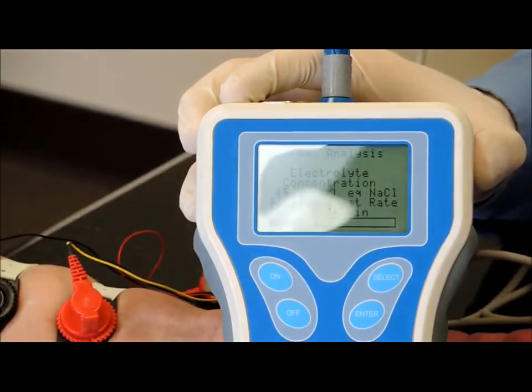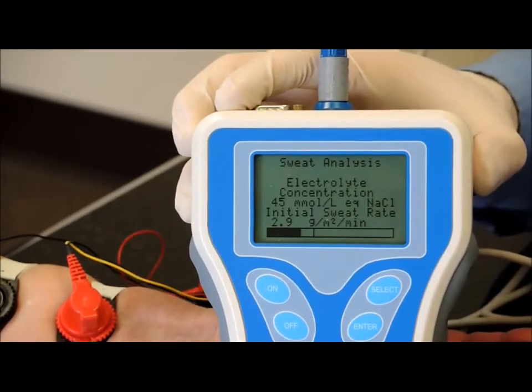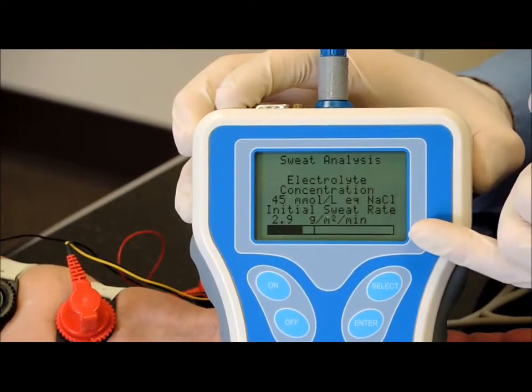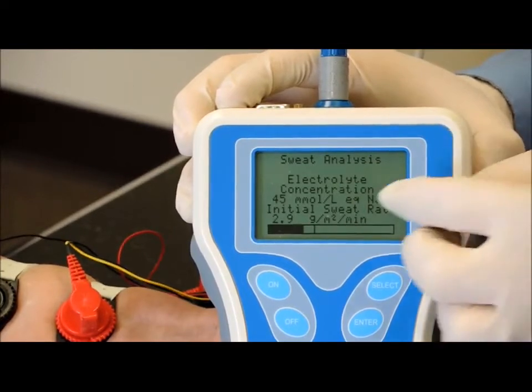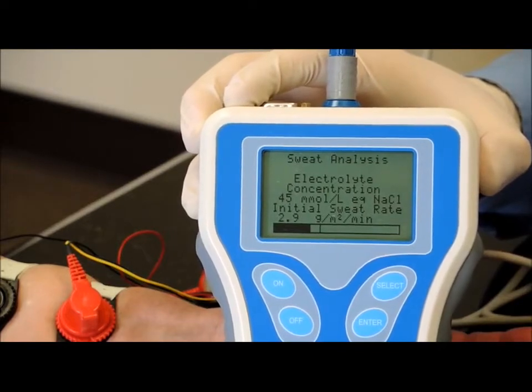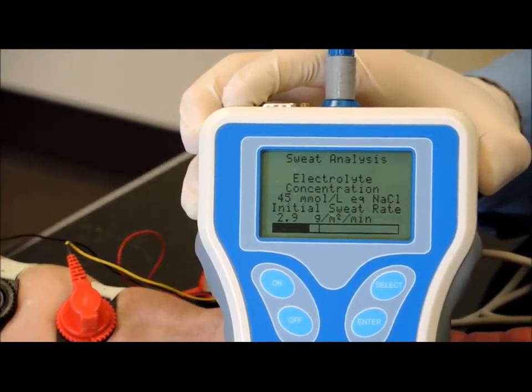Also keep in mind, if you had chosen to suppress the reading, you would not see that conductivity value nor the sweating rate. You'd only be seeing the progress bar at this point. And so those are some differences if you had chosen to suppress the reading.